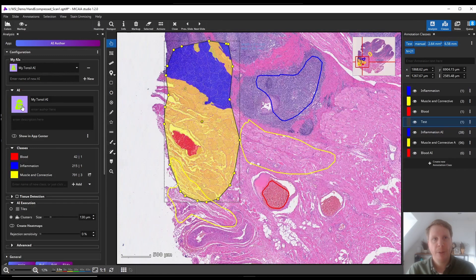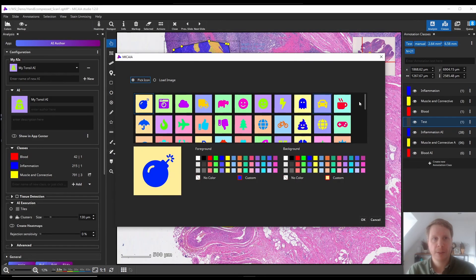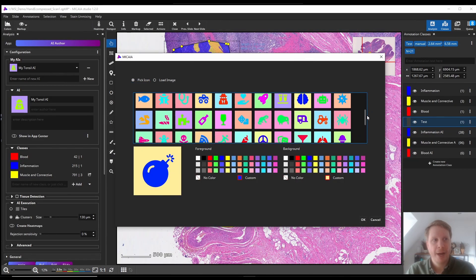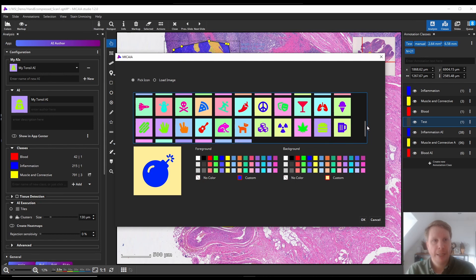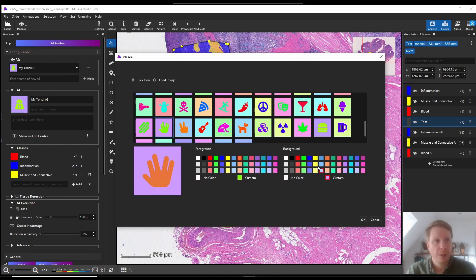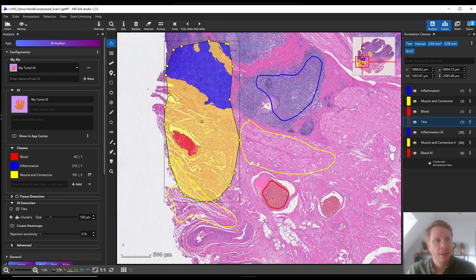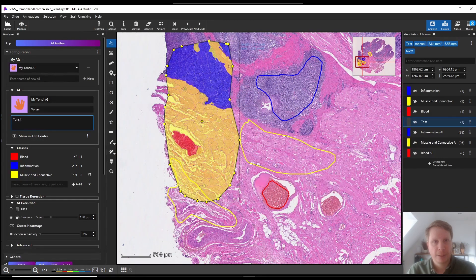Once we are happy with how our AI performs, we can select an icon, enter description text, and then enable the Show in App Center button. Going forward, our new AI model is available right away from the App Center and can be used to analyze many many slides.